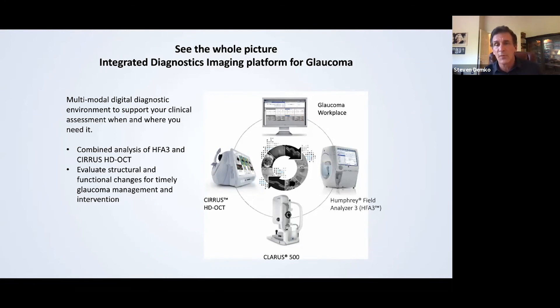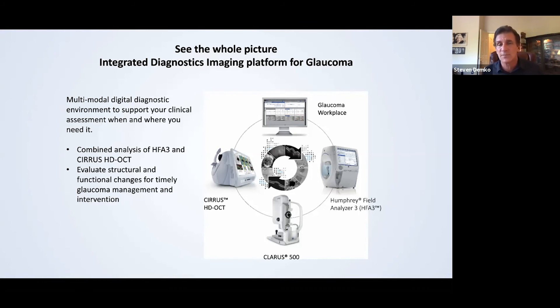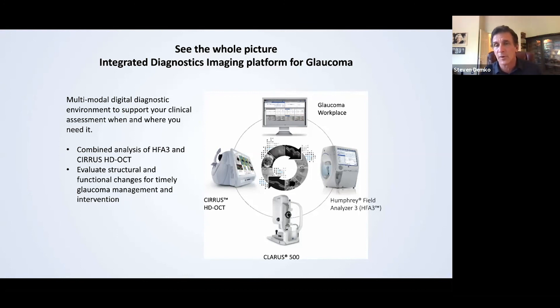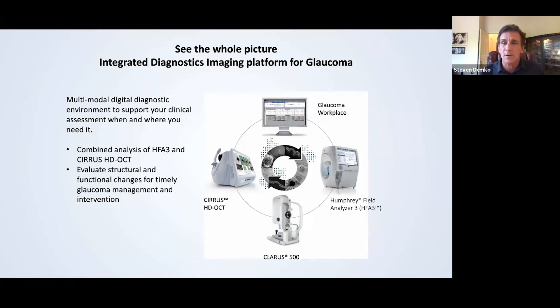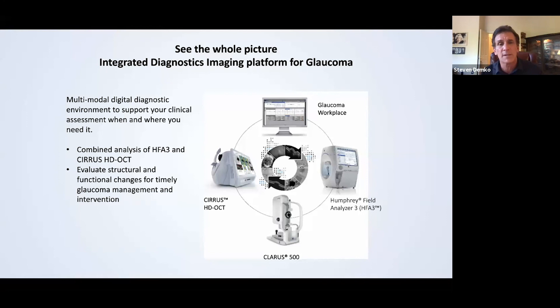With FORUM, you have a server that crunches all the data. You could take any image, it will crunch it already. And then when you go to FORUM, you press on it, it's there instantaneously. You could look at any image from the day, from the year, and scroll through all these things as quick as you could scroll. The images pop up there for you. You could compare year to year. You compare the OCT to the Visual Field Analyzer. You can compare it to the wide field images on the Claris. It makes your life so much easier.